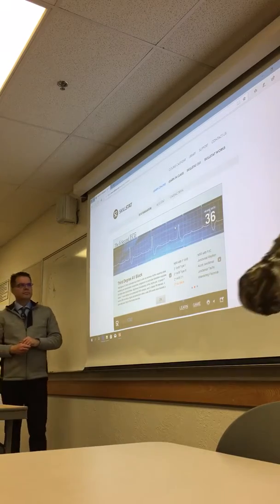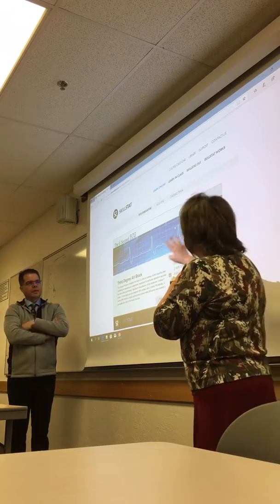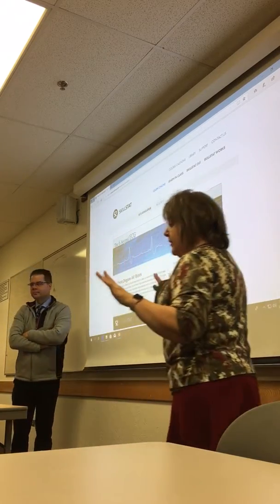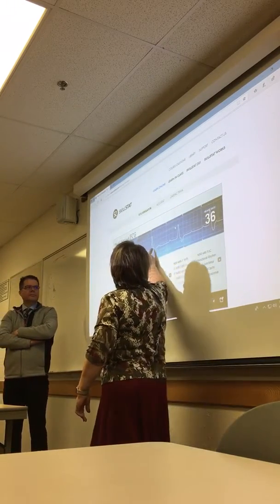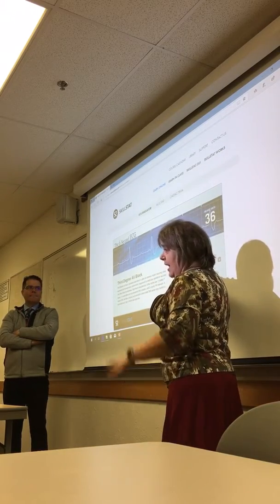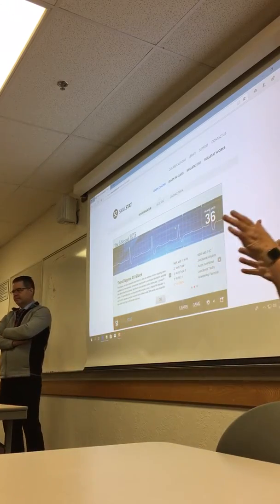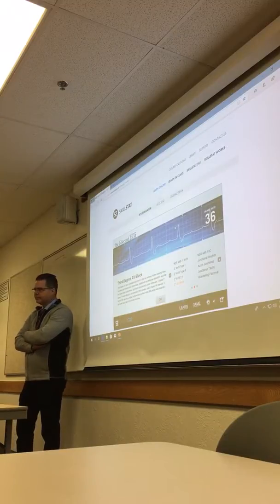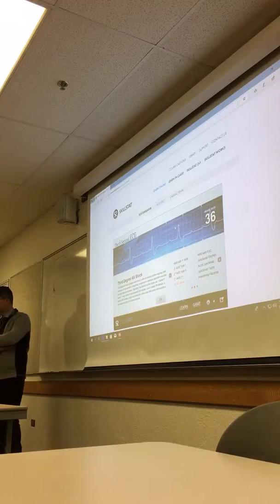So the characteristics of this one, your P waves march out. Your QRSs march out. You know, they're equal too, but they have nothing to do with each other. You can see this P wave, they just have nothing to do with them. We also know this is ventricular as to where the impulse came from, because it's big and wide. It did not come from that P wave. And it's also less than 40. And so you know that that's down in that bundle because it's a rate of 40.